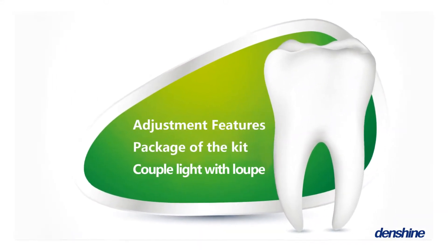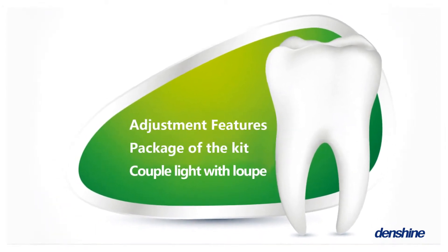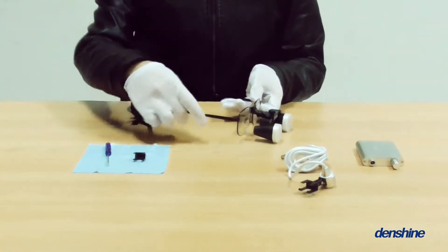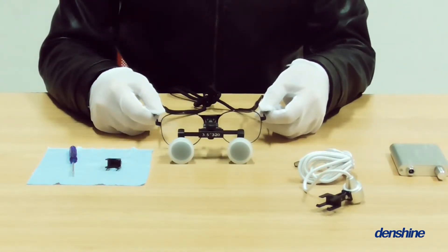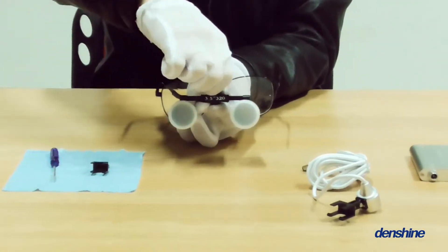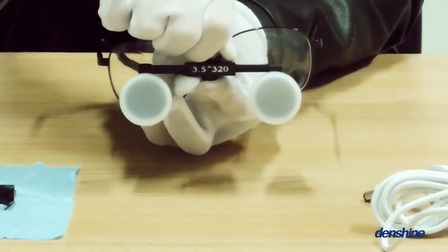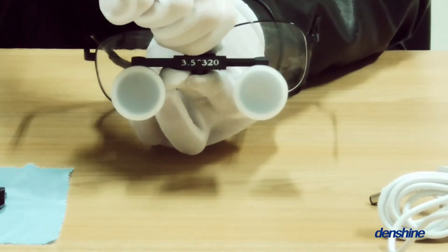Adjustment features, package, and couple light with loupe. Firstly, adjustment features. Adjust the frames to fit your need. Pupillary distance is also adjustable. Check the settings of both eyes to adjust it and focus on the object. Adjust the angle to change the angle of viewing.